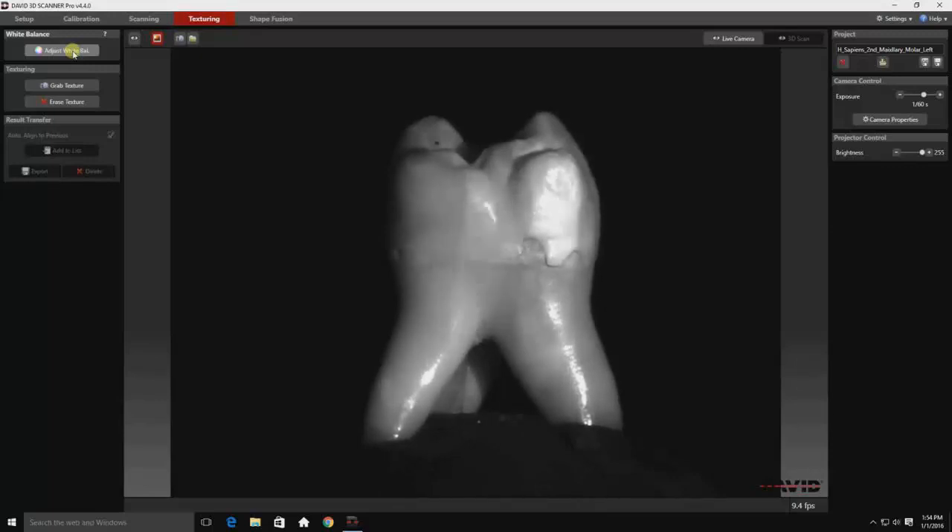Now that white balance is set, I will move on to the grab texture mode. Both of these settings allow your scanner to clearly see and interpret the object. It's no different than setting the exposure on your digital camera.